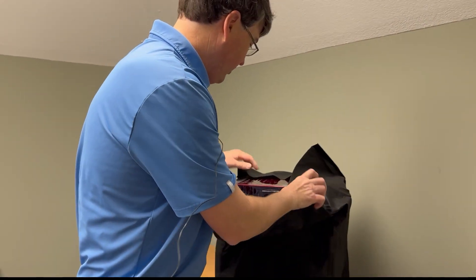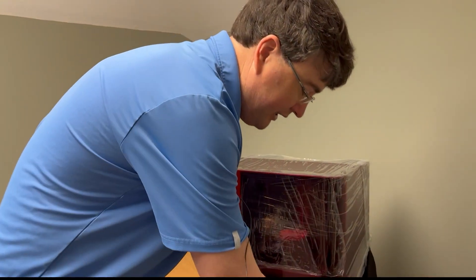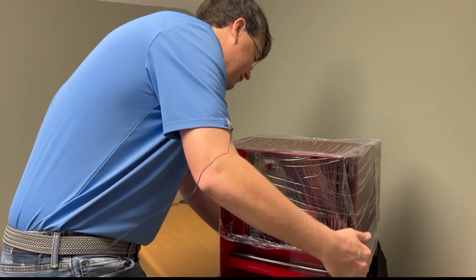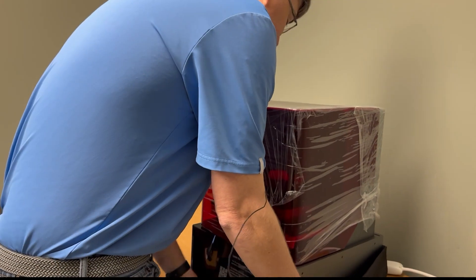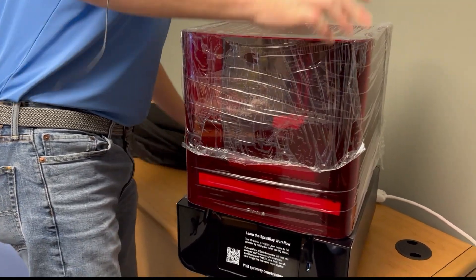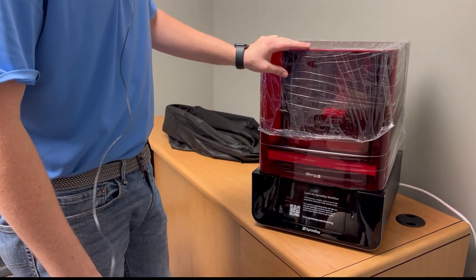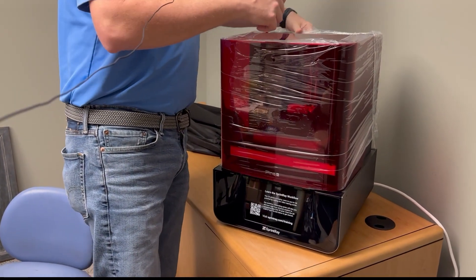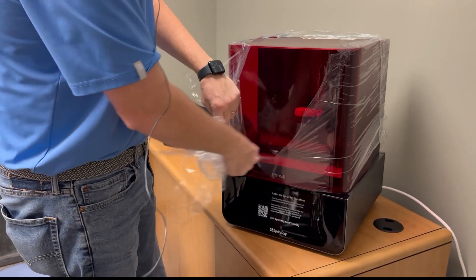Now let's take this cloth out from around the edge that helped us pick it up. That thing is pretty — man, that thing is gorgeous. Once you get it out like this, it's not terribly heavy. We'll get all that cloth out from under it. Sprint Ray has been kind enough to give us all this plastic wrap — let's just take all this off. You may be doing this with me at home — this is pretty fun.